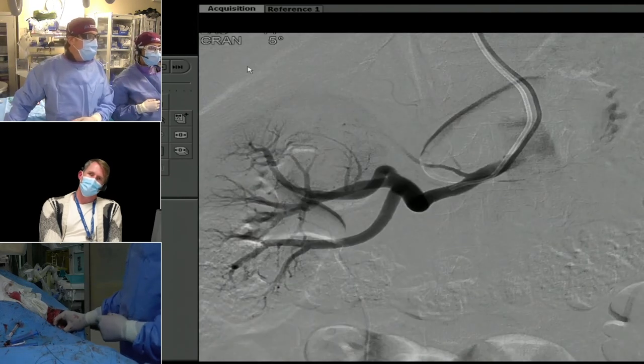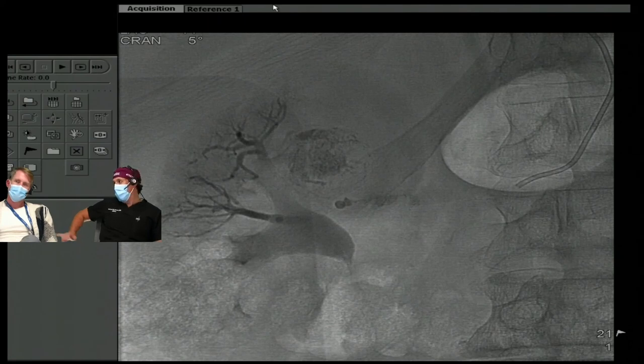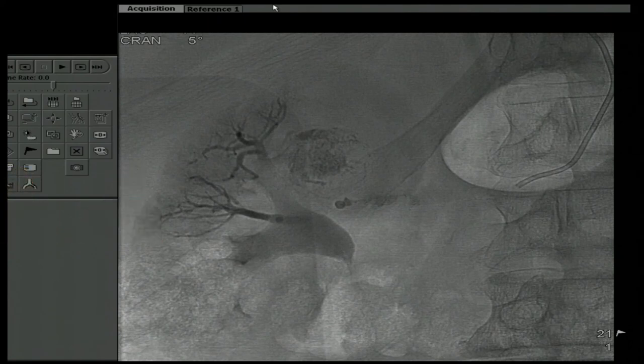It's a better oblique. All right, so let's put that image up here. I just wanted to show this image. This was the final image from the case that we just did in room one. Blue is looking at this for the first time. We actually got a fair amount of perfusion in there. There is definitely a little bit of non-target on that side. There was really no way to avoid that. If we were going to truly embolize this, that was really the only way to do it. So the decision was either embolize it and get a little non-target, or don't embolize it at all. Obviously he was here to get this embolized, and I didn't think this ablation would be as safe without this type of pre-embolization. So that was the final image.